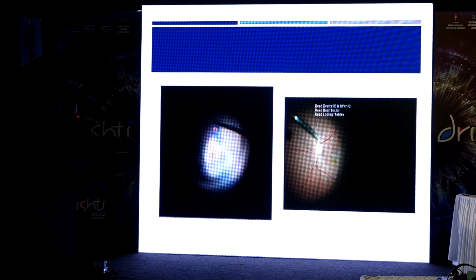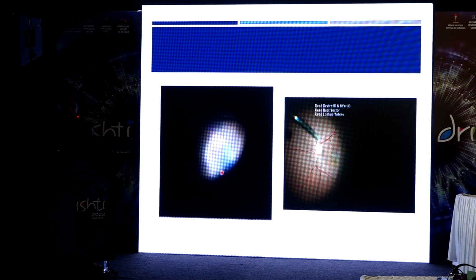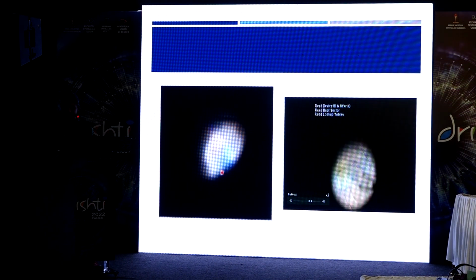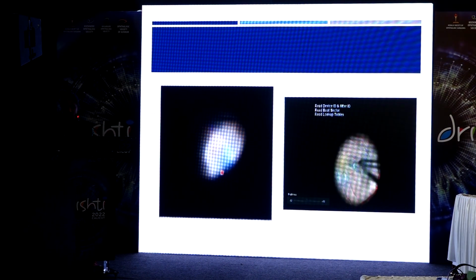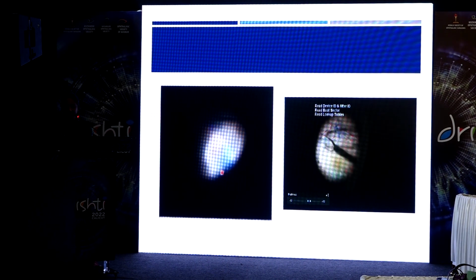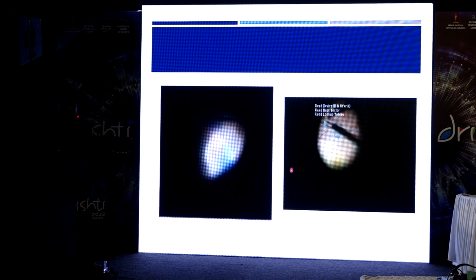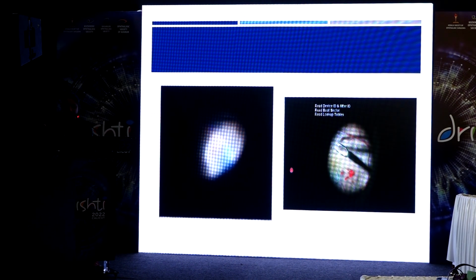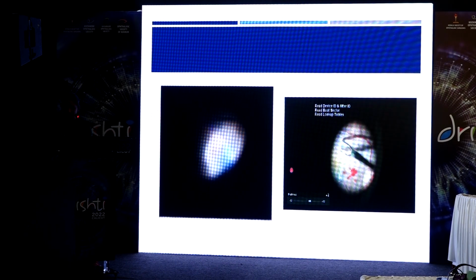Sometimes the ERM can come off like what we do in capsulorhexis, as a maculorhexis very easily, but sometimes it may be difficult. So chromovitrectomy and staining of the ERM usually help. Usually the PVD will be present at the start of the surgery in most cases, but in some cases the posterior hyaloid will be attached. In these cases, we should be extra careful. The removal should be as gentle as possible. There will be some kind of ILM attachments throughout the vitreous. So you can do staining and removal multiple times, and do the peeling as much as possible.